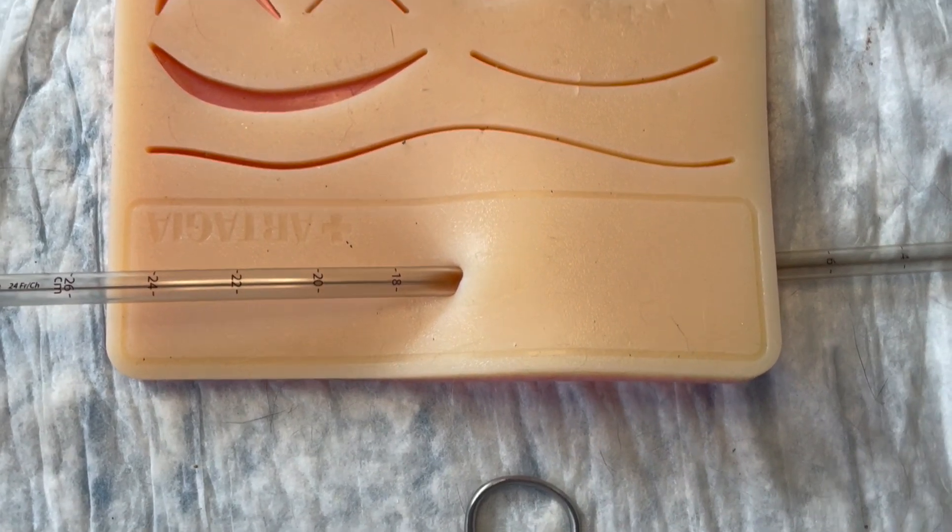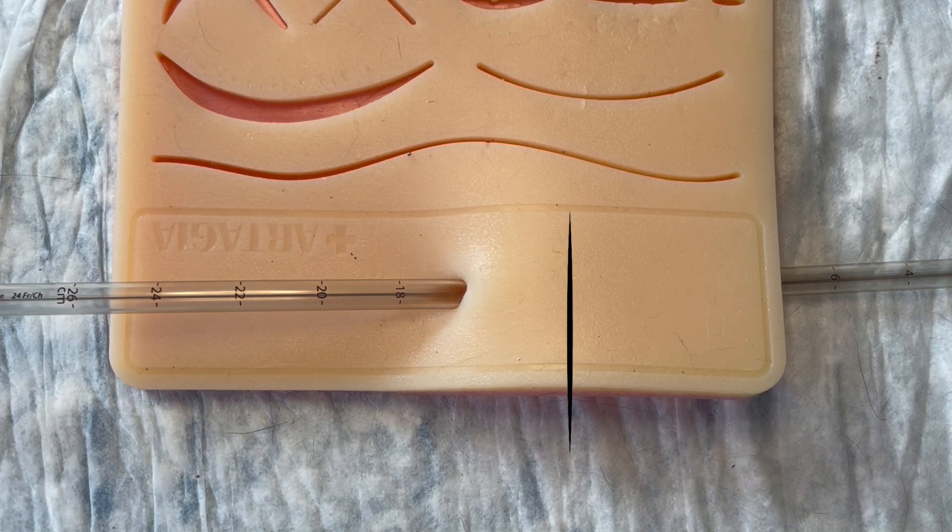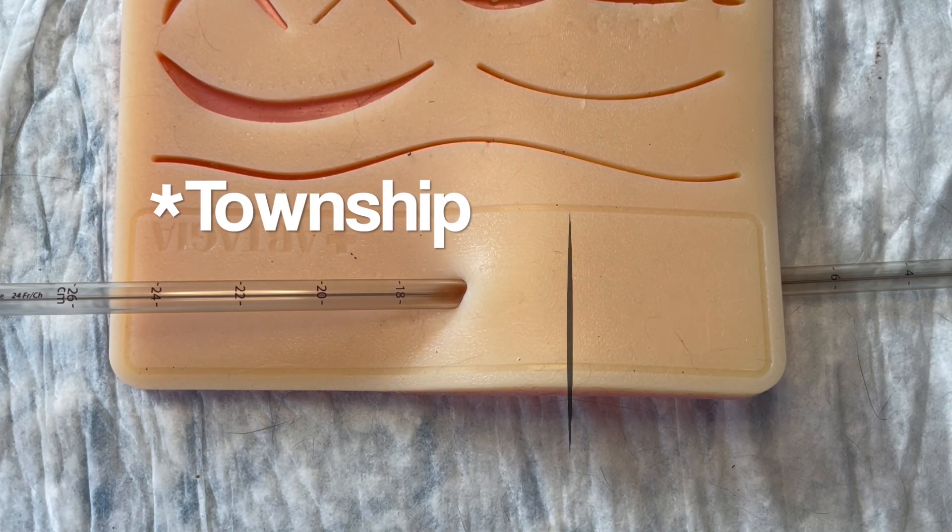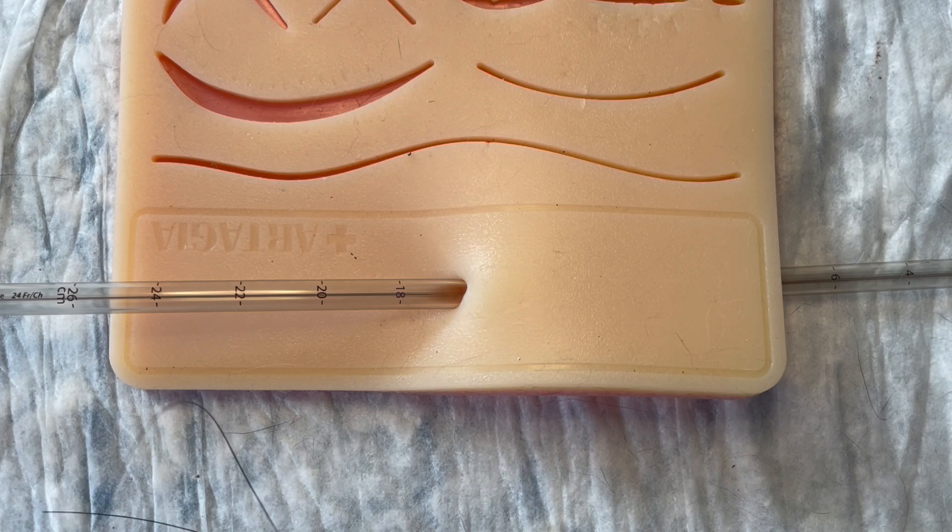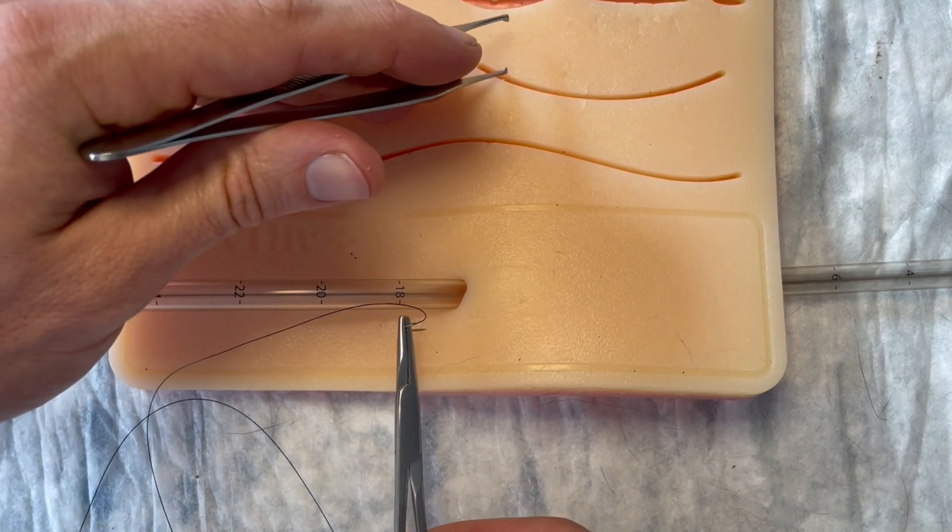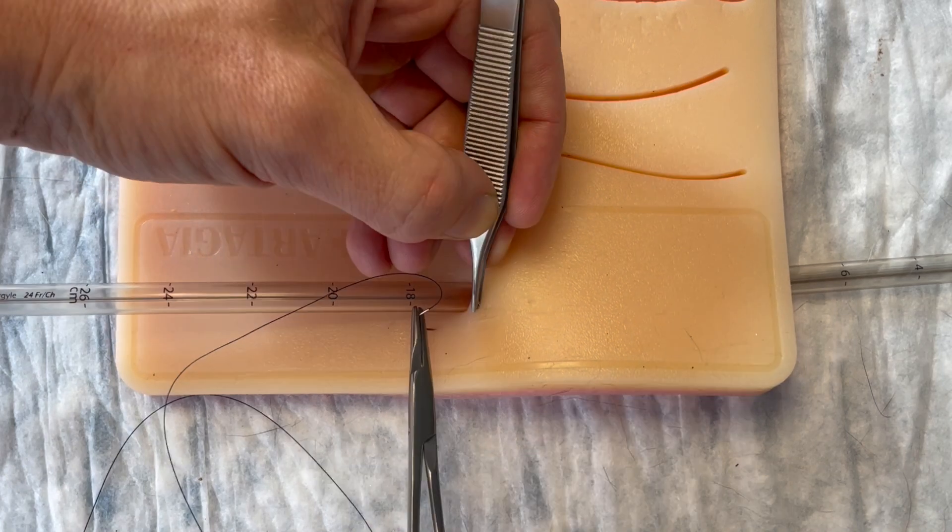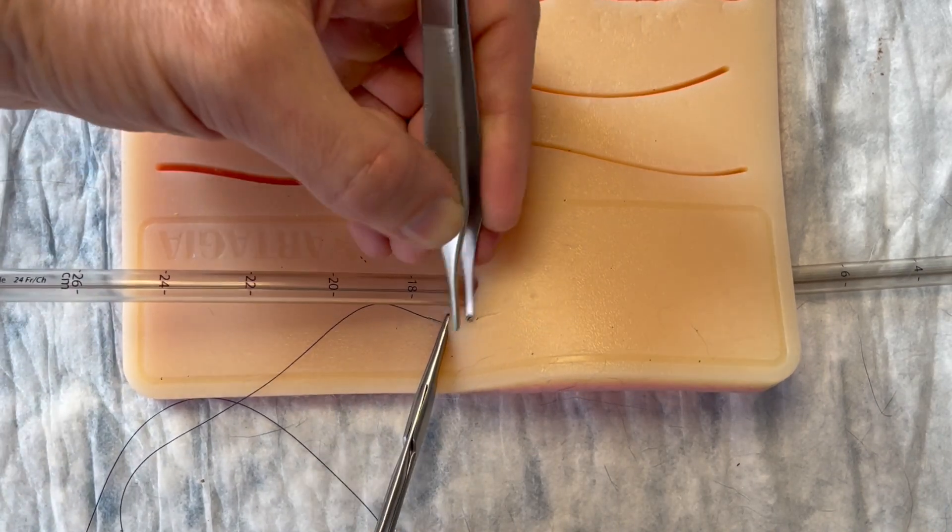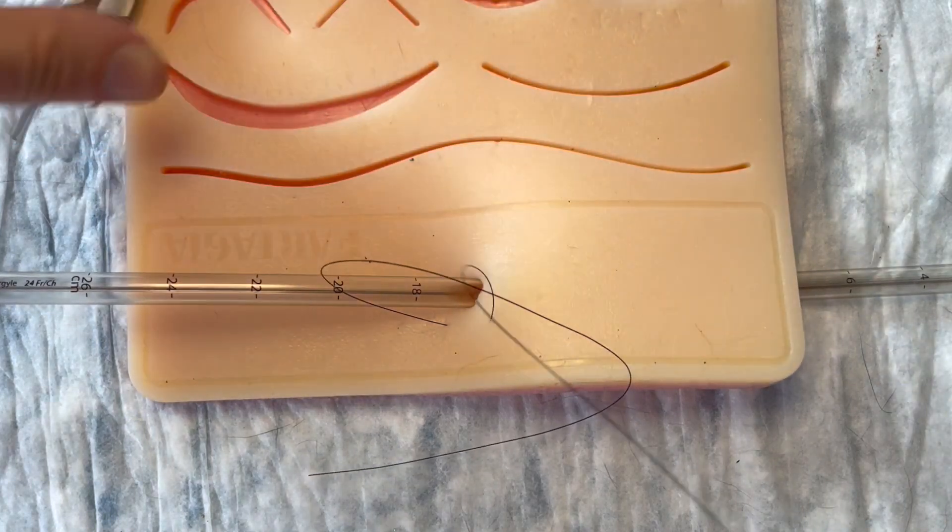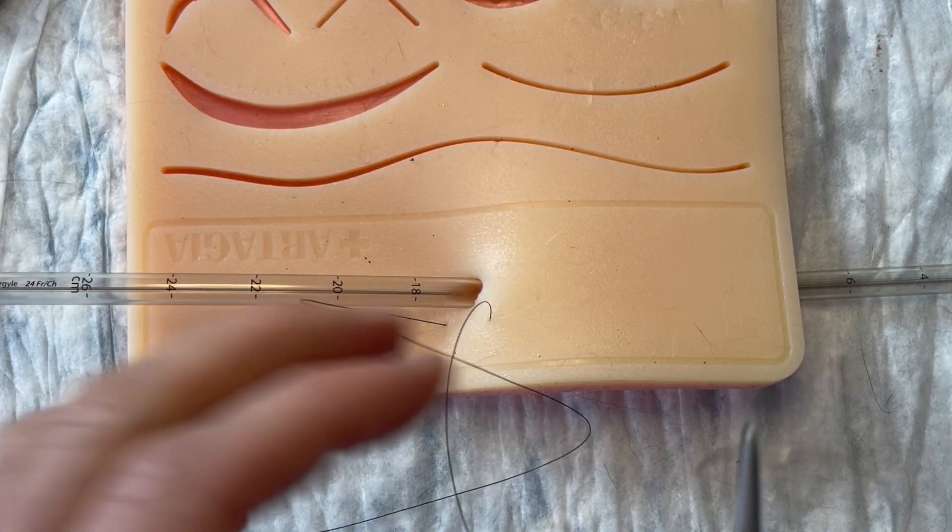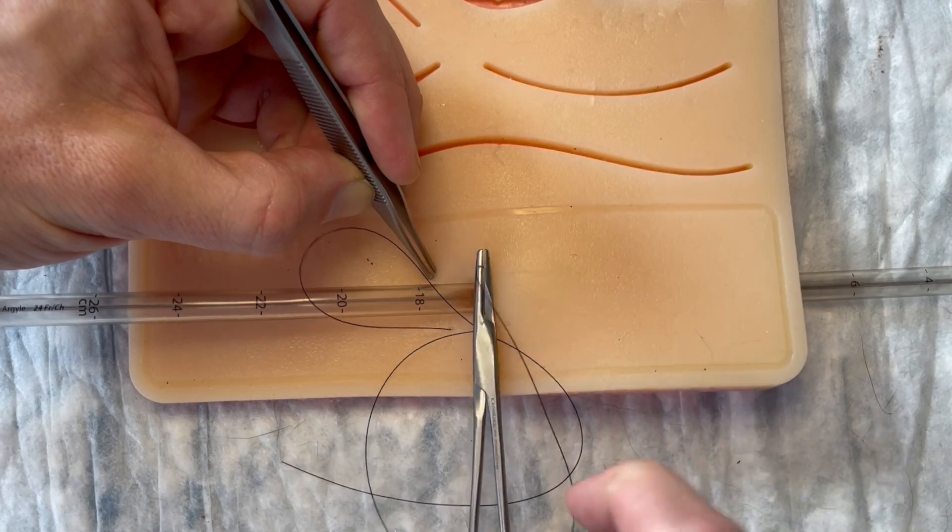Okay, moving on to the large bore chest tube, our 24 French here. We're going to do what's called a Soweto tie. It's called a Soweto tie because there is a city in South Africa that has a high crime rate and there they did this type of tie and then coined it a Soweto tie at that point, so that's where the name comes from. So we've got our large bore here, we're gonna create our bite and we're gonna do kind of a horizontal mattress around the chest tube here, come out the other end here.